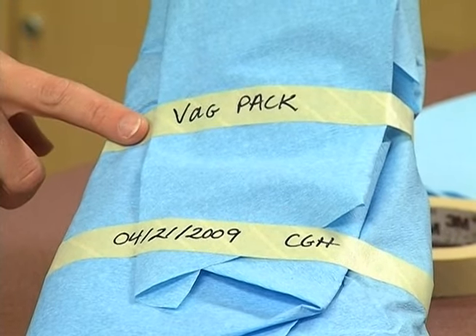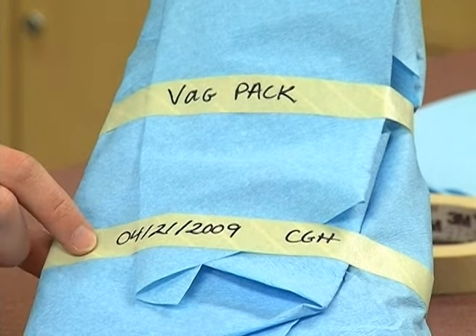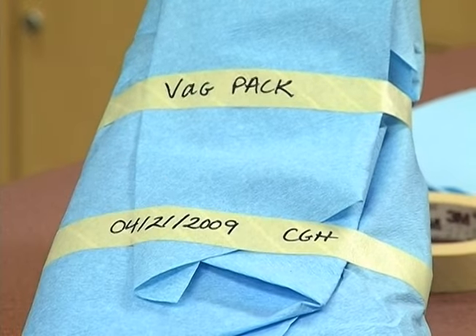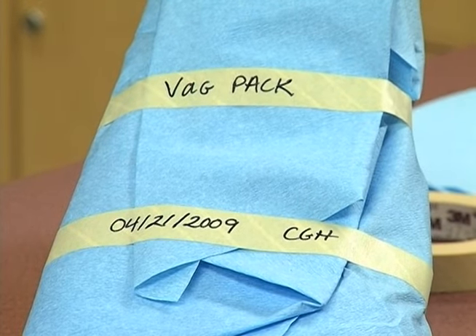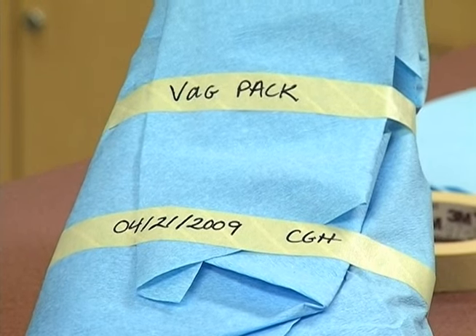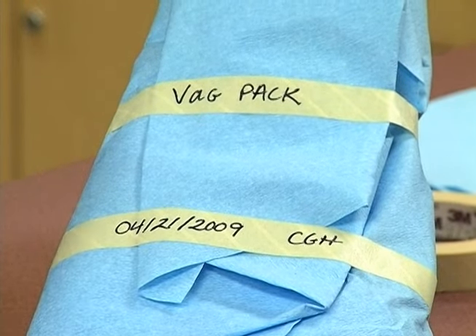So that's what we firstly need to have on there. It's what surgical instrument. Next, we need to include the date that we're going to be autoclaving it, and we need to include our initials to allow people to know that we were the one that put this together, just in case later if any changes need to be done to the procedure, we can do that.